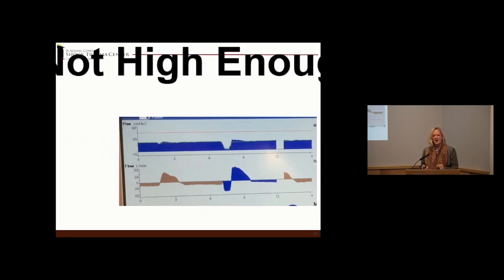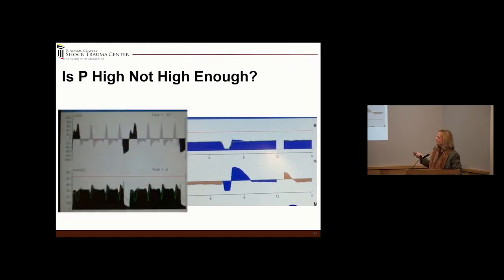Versus, is it not high enough? And if you can look here, this airway pressure, this is where it's good to be short and wide. Tall and skinny is not good. And you can see that this patient cannot even take a breath. They can't sustain that breath. And you can see also it is in excess of the machine flow volume.